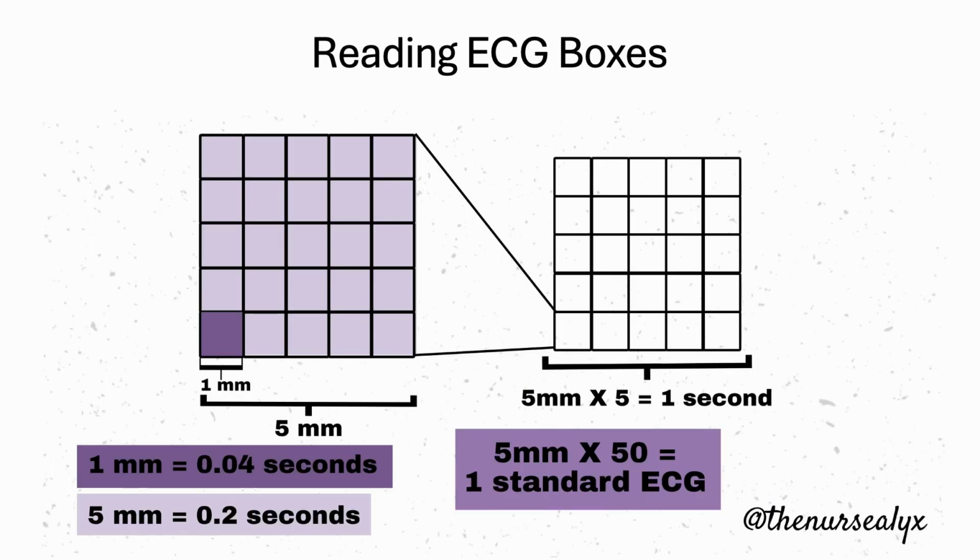If you haven't had the class already, you will have one that talks about reading ECGs, electrocardiographs. This should be an introduction for that if you haven't. Most likely you're not going to measure ECG waves in the sleep study. However, if you know the basics about reading ECG, you can describe what you see that may be abnormal and assist the physician in a proper diagnosis. It will also help you to know when life-threatening heart rhythms are happening.